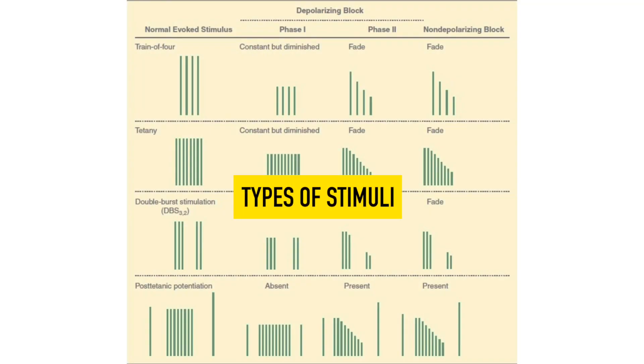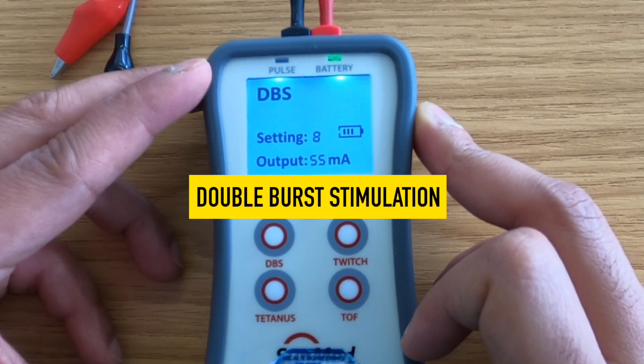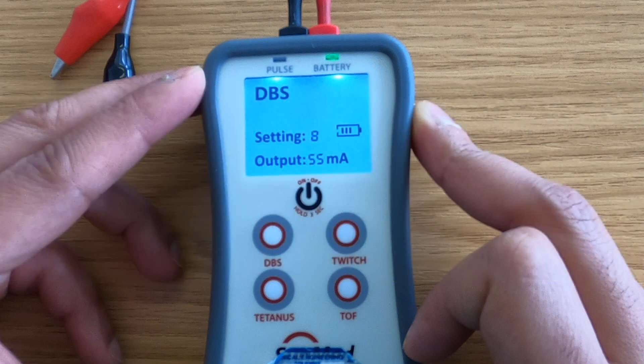Types of stimuli. Double burst stimulation or DBS: this produces two short sequences of 50 Hz tetanic stimuli separated by 0.75 seconds. This stimulation should not be repeated at intervals of less than 12 seconds.